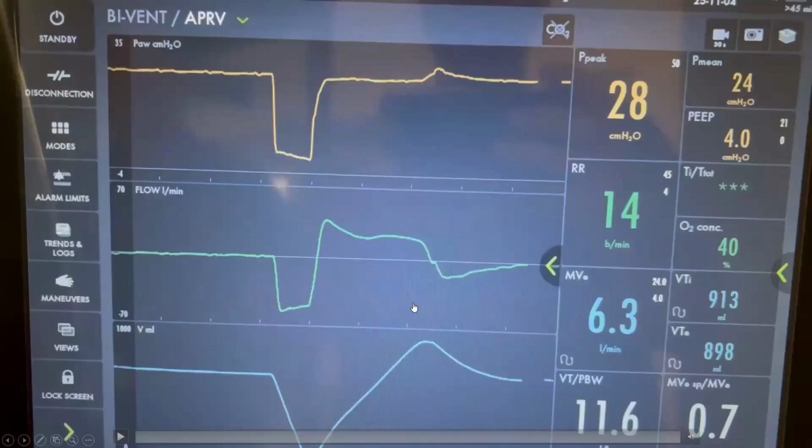Again, this is another zoomed-in version of somebody who's not spontaneously breathing, but I can see they are. When you have this big long stretch here, and then they empty, see how it's flatter here because they're pushing, and then when the P high inflates, you see the dip there, and it goes out, and then it goes negative. That person's exhaling right there. Okay, and you see the volume is up. So either they're not awake, and also another key is look at the tidal volume. Nobody should be exhaling 900 tidal volume in 0.5 or 0.6 time. That just means their overall lung volume is enormous. It's a lot more than what it should be.